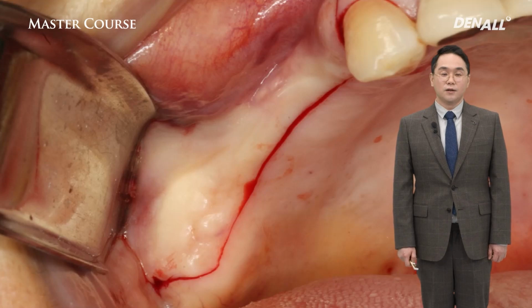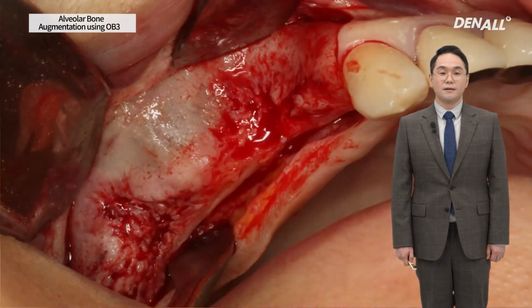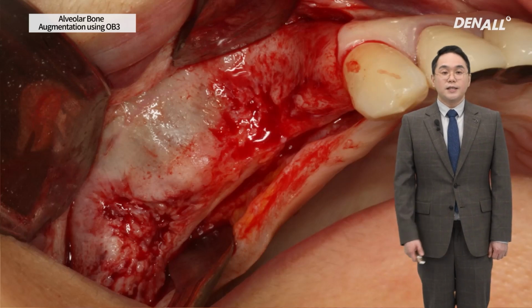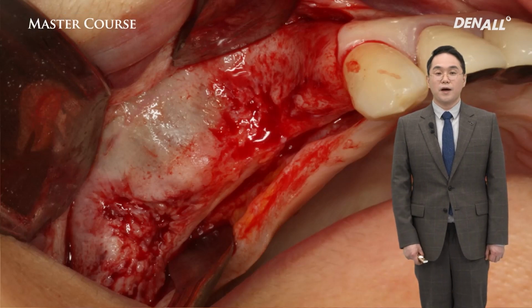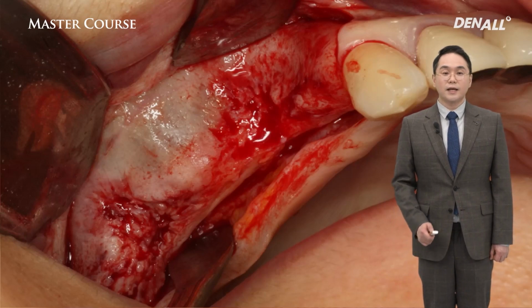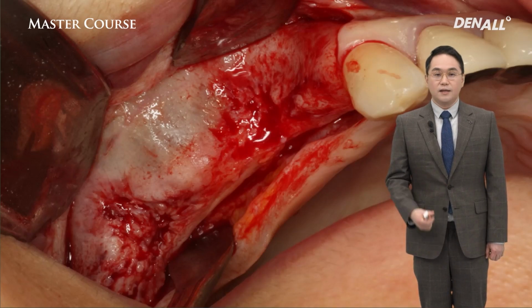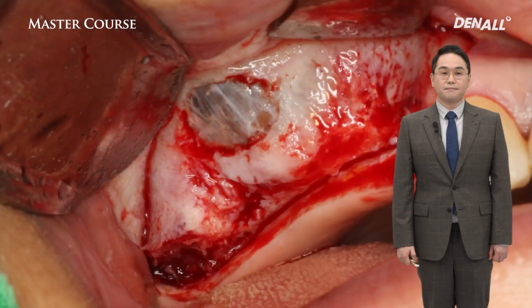2 vertical incisions and crestal incision are made. Flap is raised. As we saw in the pre-op CT, the residual bone in the posterior region to the sinus floor is only 2 to 3 millimeters. So lateral window approach is used to lift the sinus membrane and to perform sinus bone graft.